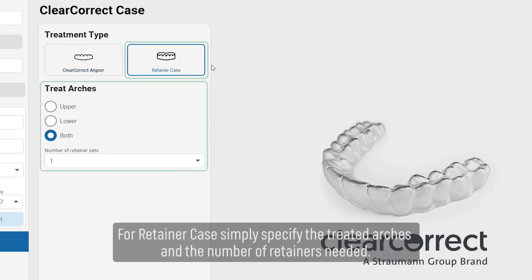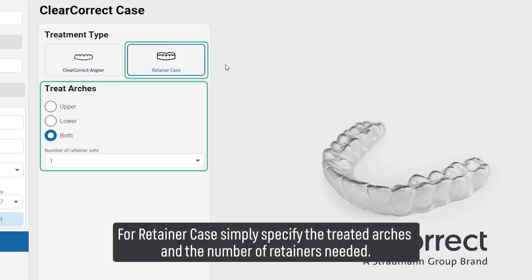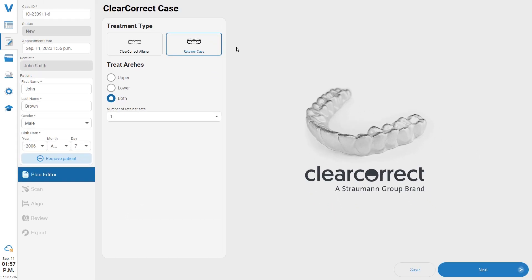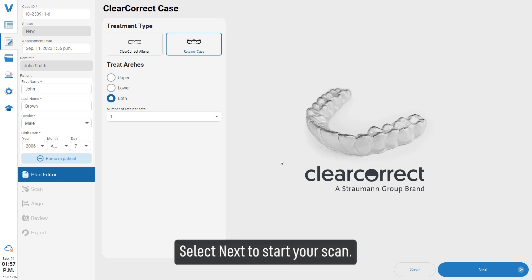For a retainer case, simply specify the treated arches and the number of retainers needed. Select 'Next' to start scanning.